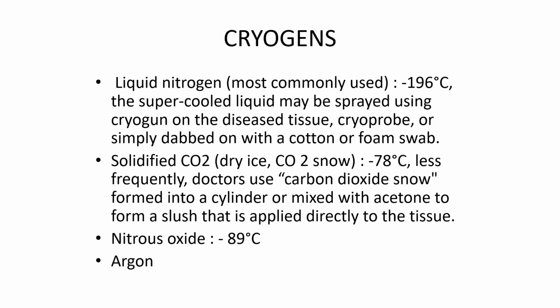Super cooled liquid may be sprayed using a cryogun on the diseased tissue or simply dabbed on with a cotton or foam swab.